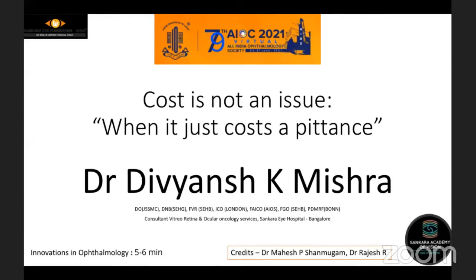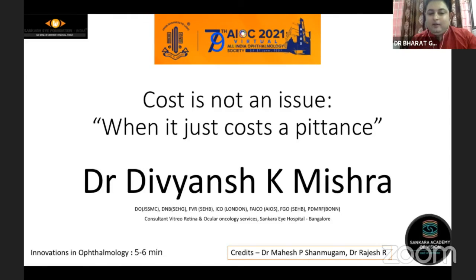Can I ask a quick question, sir? Yes, sure. Have you any experience of putting it on the BIOM lens for VR surgeries? We have not tried it on the BIOM lens, sir. Since we had submitted and published this, the same query came from the reviewer. But since this solution can't be sterilized, we have not tried it on BIOM yet. If in future we can sterilize it, we can try it on BIOM also. Probably. Fine. Thank you.